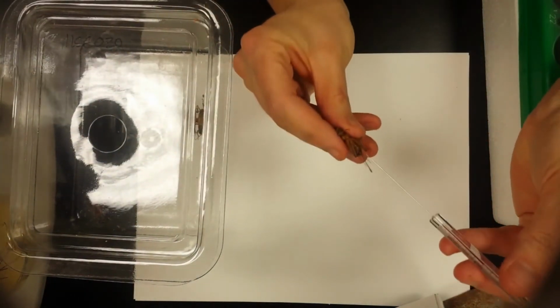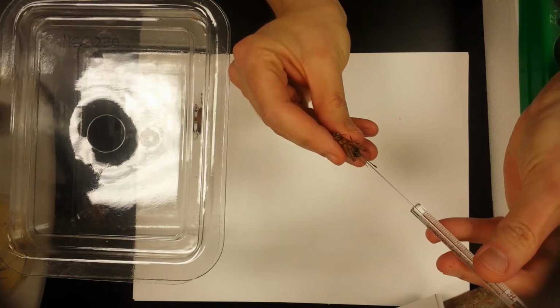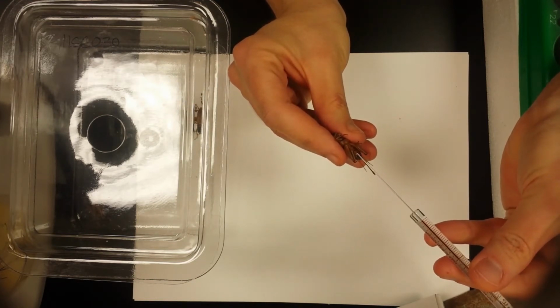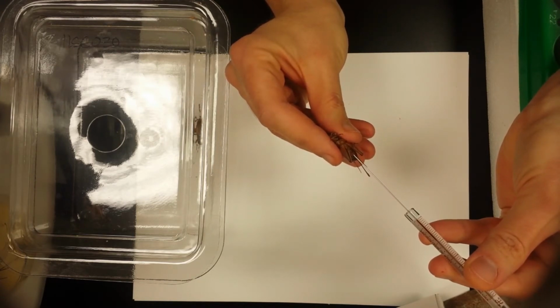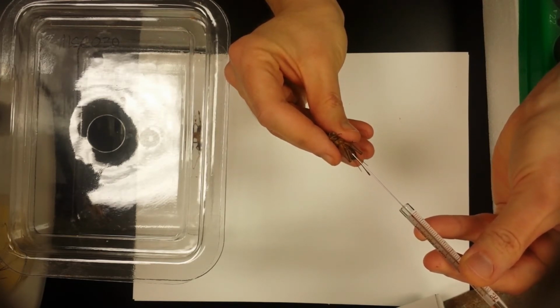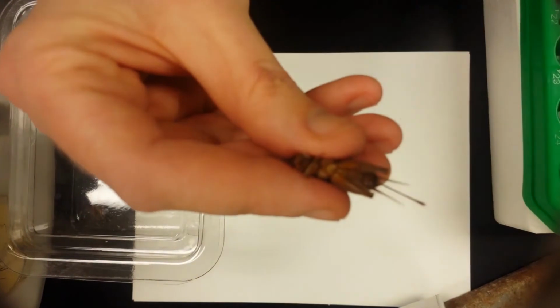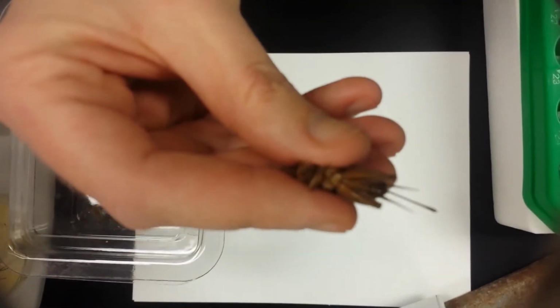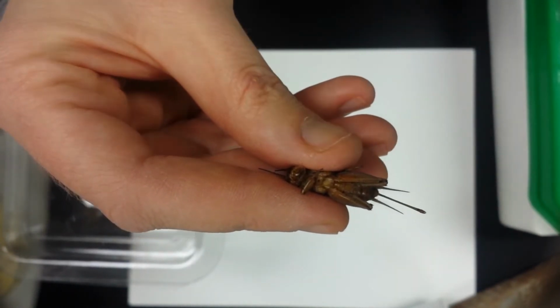I have to brace my arm against something stable to do this. So I'm going to insert the needle between a couple body segments here in her abdomen, and then I'm just going to slowly inject in this amaranth solution. She's trying to be really disgusting by spitting out some of her stomach contents right now. Okay, so there she is. She's been injected, and then we'll wait and come back and take some blood samples.